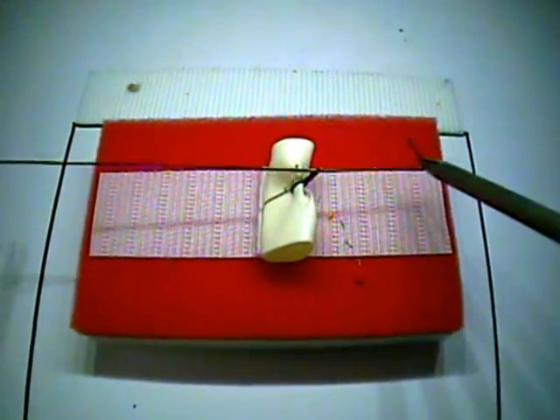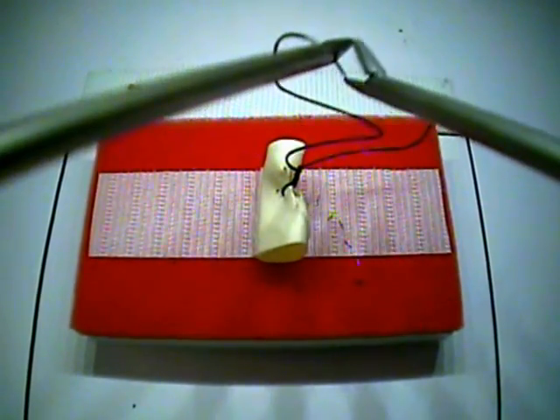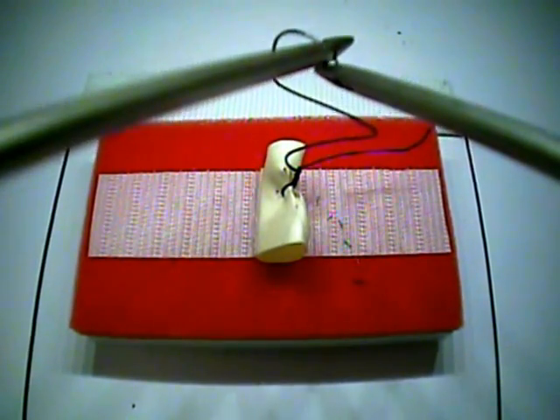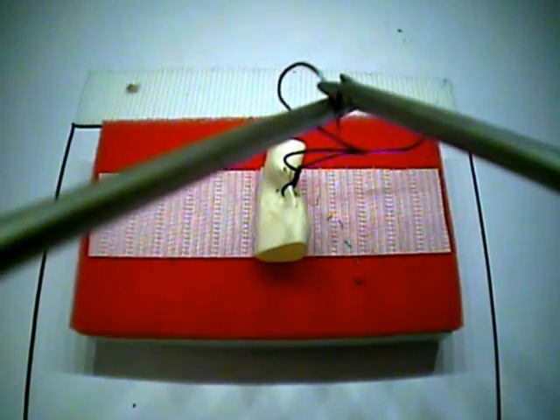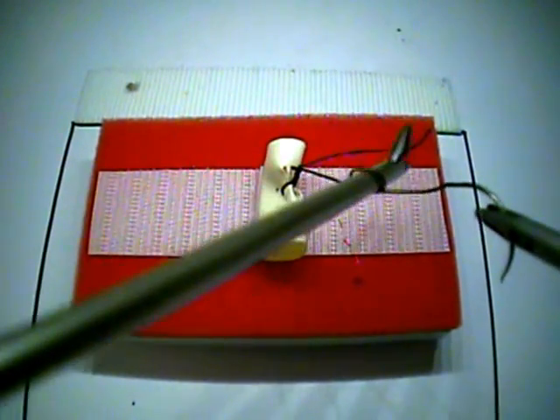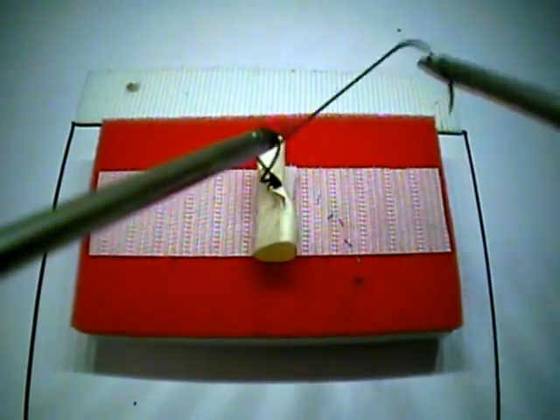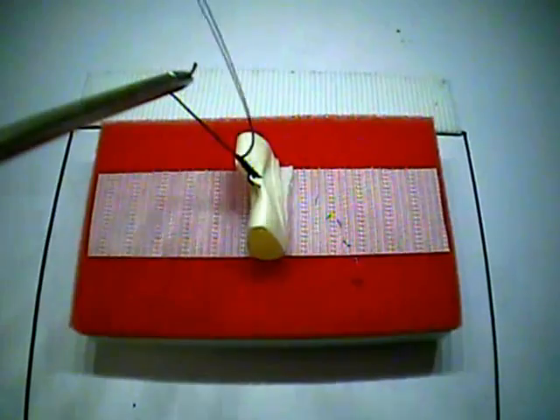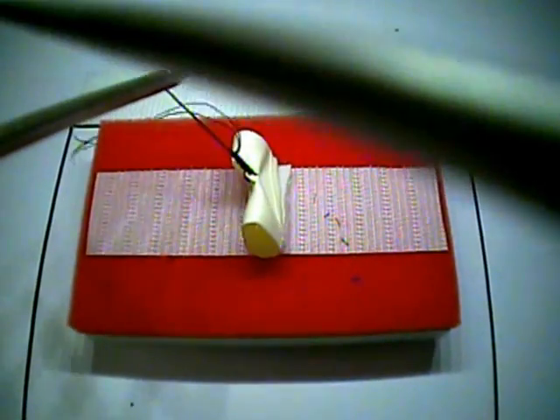So again, for the exercise on the FLS exam, three throws are required before the stitch is cut. You can see how you continue to get extra practice out of a single stitch.